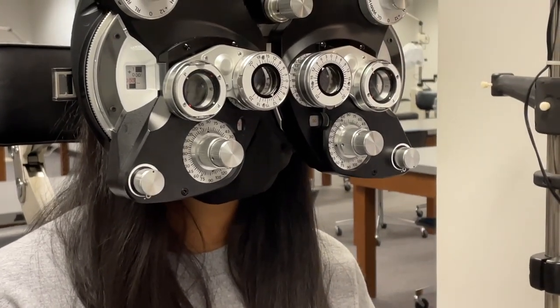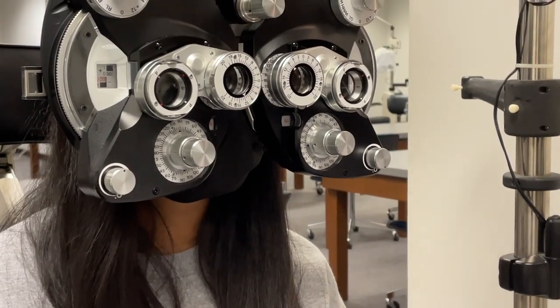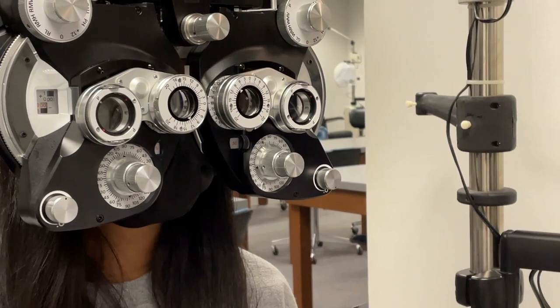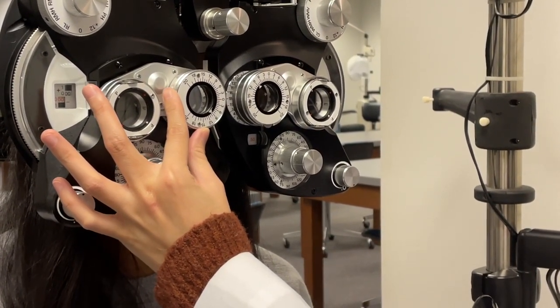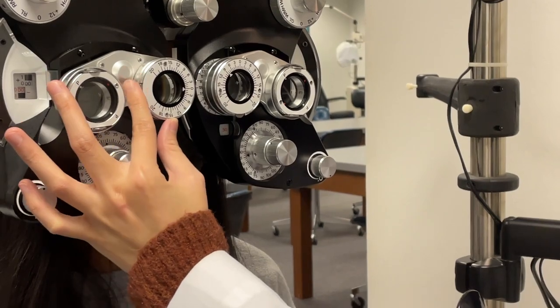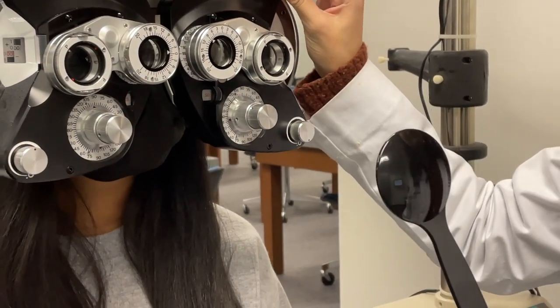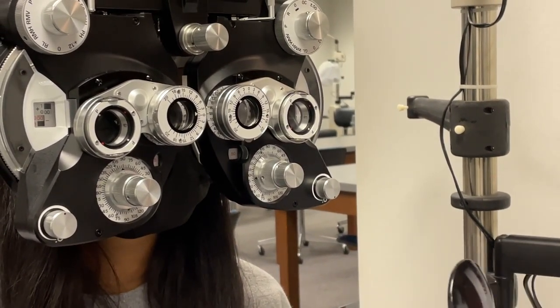All right, you should see two charts again, one on the top right, one on the bottom left, is that correct? Mm-hmm. Okay, so now I'm going to be moving the one on the right to measure your vertical deviation. Let me know when they line up right next to each other, like headlights on a car. There. Okay, and she has a 1 prism diopter hypophoria.